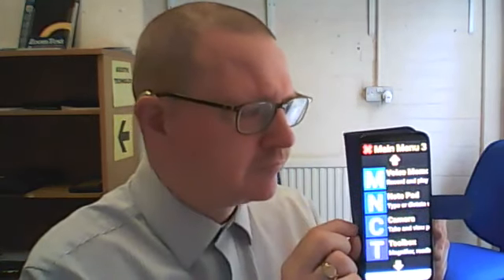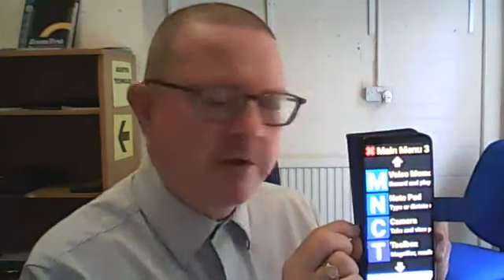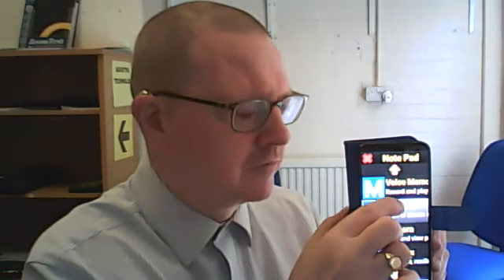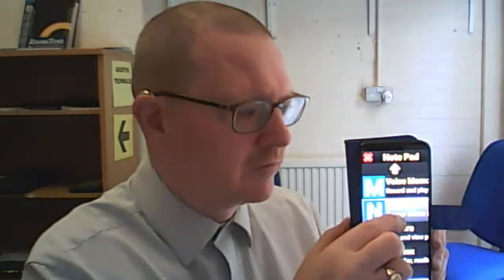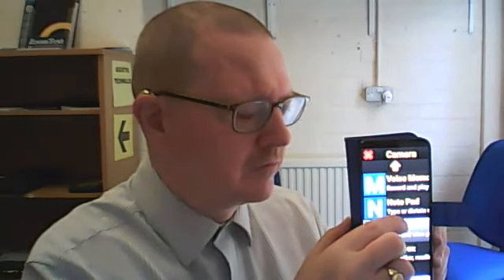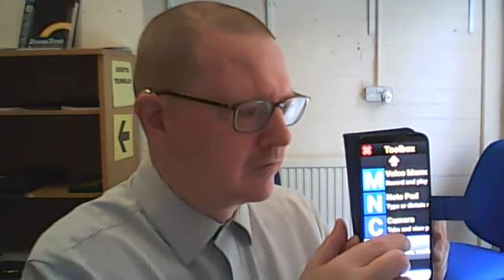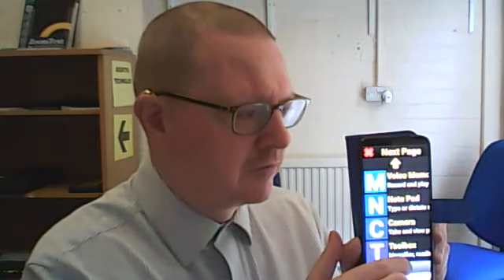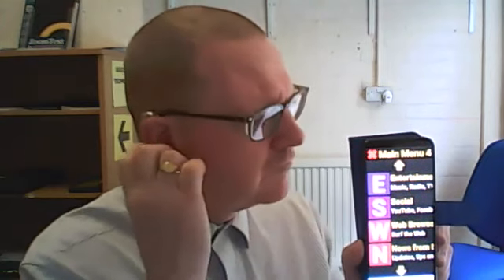Main menu, page 3 of 5. So the things become a bit more sophisticated the further you go down. Voice memos, record and playback. Notepad, type or dictate notes and lists. Camera, take and view photos. Toolbox, magnifier, reading machine, etc. Next page of main menu, page 4 of 5.